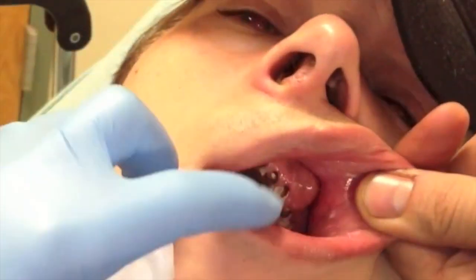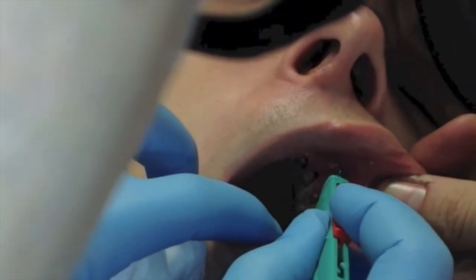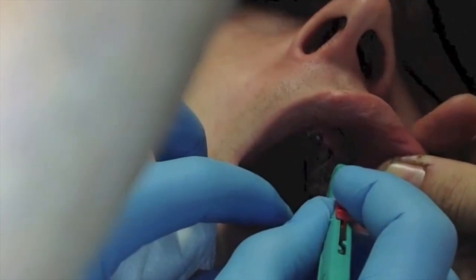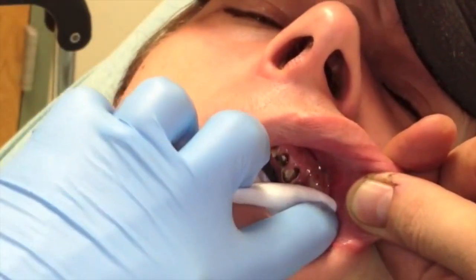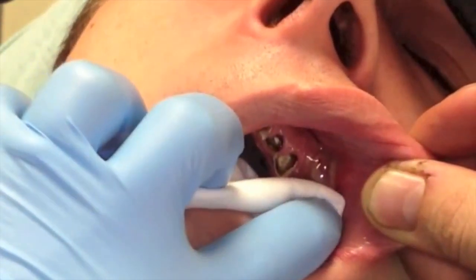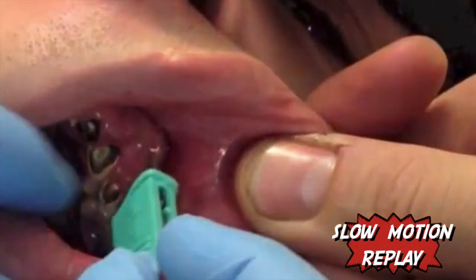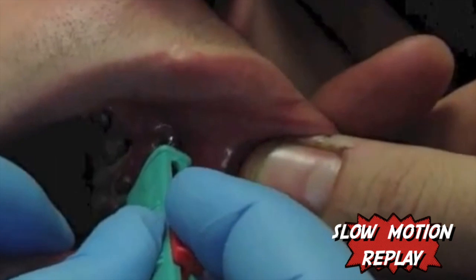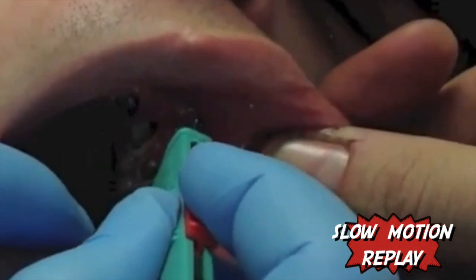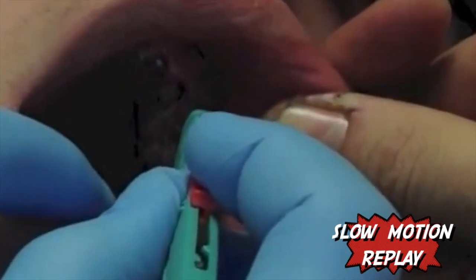He's there helping me to hold it open because I was having a lot of trouble holding. And there I am using the blade to cut and obtain the abscess. Don't worry — if you didn't see it, I'm going to do a slow motion, a little zoomed in, so you can see. Definitely a lot of pus being obtained from that abscess drainage. You can see the blade cutting just at the top of the fluctuance right there, just a nick in the skin of the gum, and there it goes.